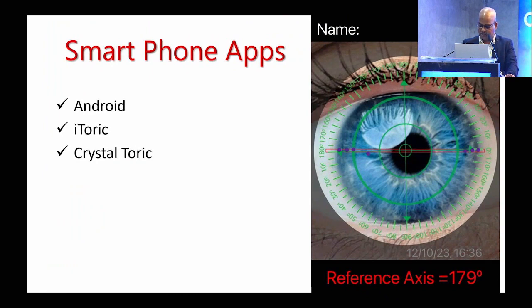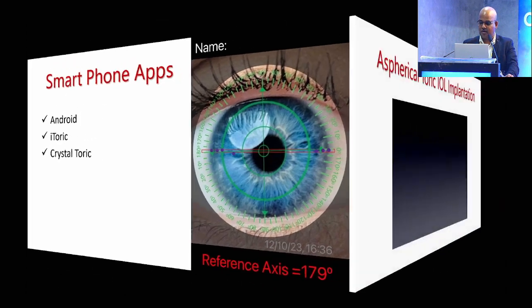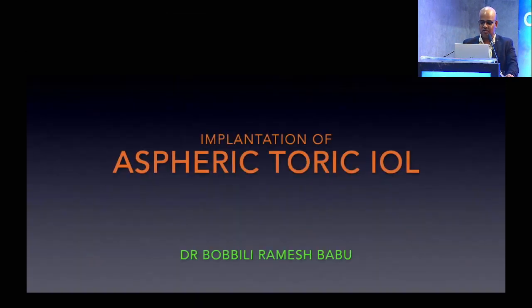For Android, we have different apps like iToric and Crystal Toric. There are many apps, and every app works very well, so you can depend on these things. There is no need for high-end equipment like this one. This is how surgery is being done.